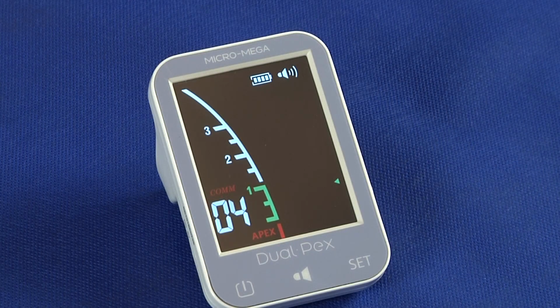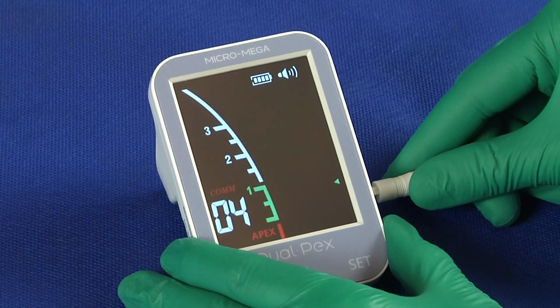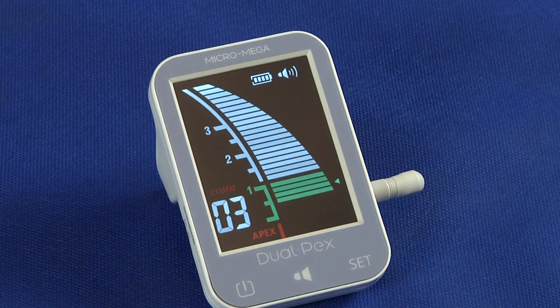Checking the device before use. Plug the tester module to Dual PEX on the right. The device is in good operating condition if the bars reach the green area and if the number of remaining steps before the apex is between 2 and 4.